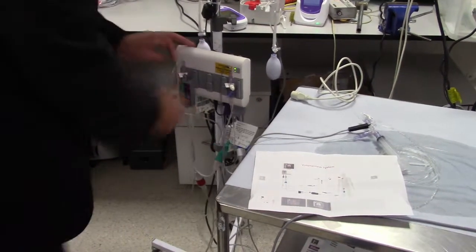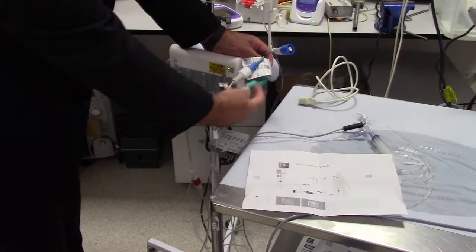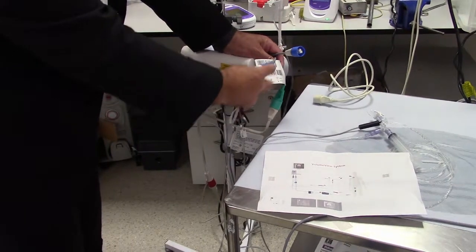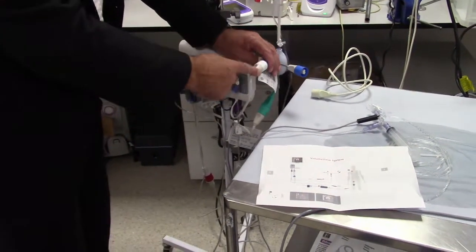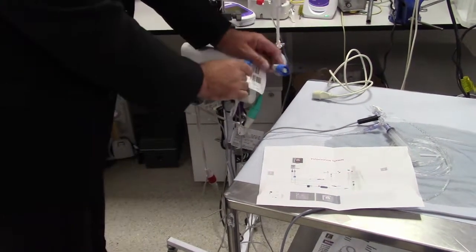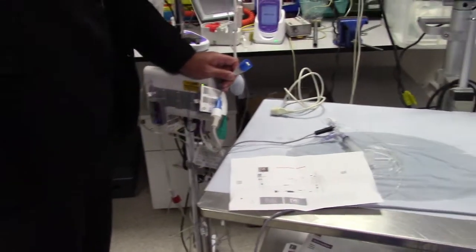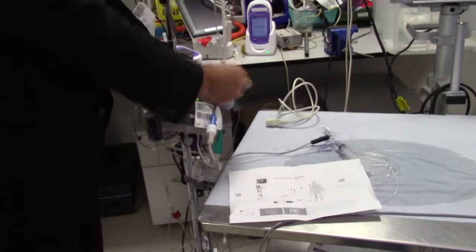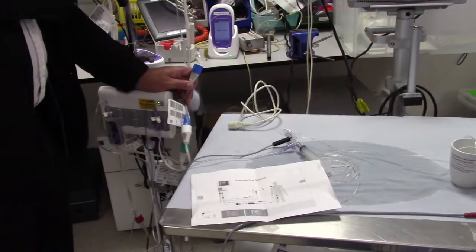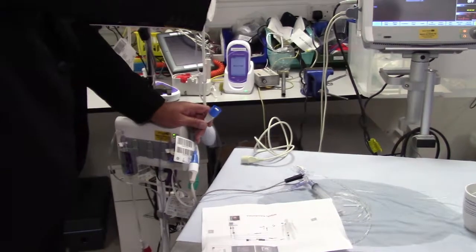The second part of the connection is the central venous catheter. If you look at this pigtail at the back, we have green to green, which is the monitor communication back to here. We then have the blue input, which means we take the CVP pressure back to this monitor as well. But of course, you then want a signal to go back to the bedside monitor, so this is the blue to go back to the bedside monitor. It's just a standard transducer cable that would connect to here and go back to your bedside monitor. So they're the connections. We simply have two cables that would come back to here, and then the two outputs, CVP and arterial, to go back to your bedside monitor.